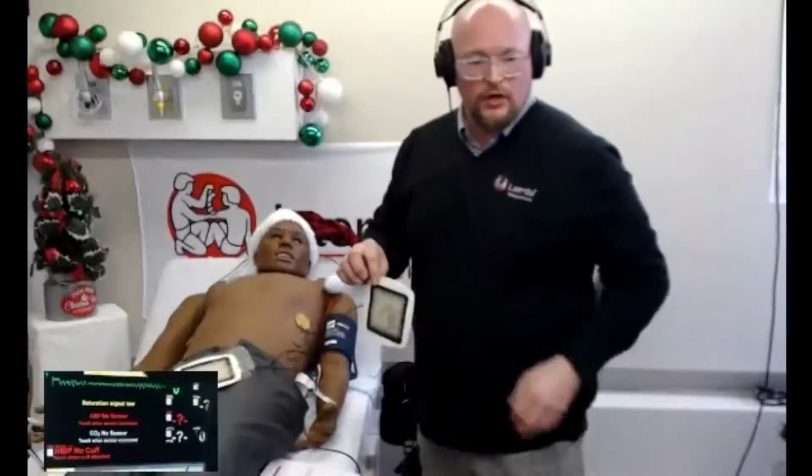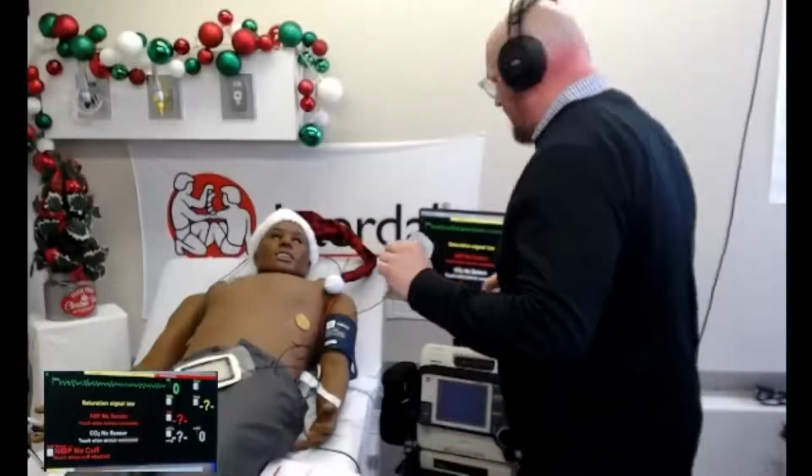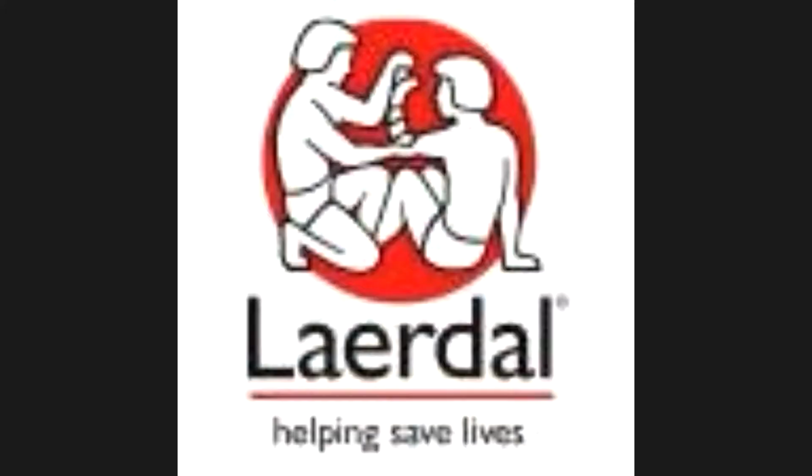Glad this is all good. So if it's something regarding this, great. If it's something regarding something else, oh, there's a good one actually. Since you were talking about scenarios, there's one saying, during the scenario, I can imagine learners will be pressing these pulses. How do you override this so they don't change the scenario?